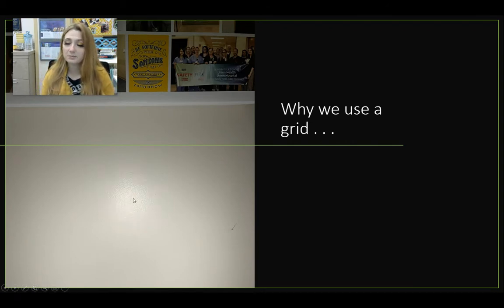The same thing happens with the X-ray beam. The X-ray beam has a lot more X-rays right in the middle, and as it goes out, it doesn't have as many X-rays. So it's a lot more concentrated in the center. A grid helps deal with that, and it makes the image even. That's a very basic way to explain it, but your books are pretty detailed, and that kind of helps you put it into practical application.